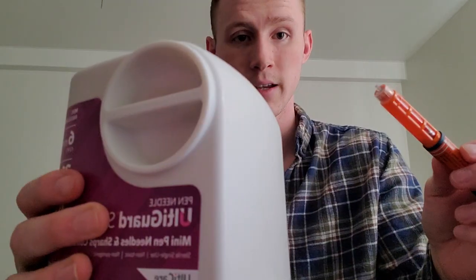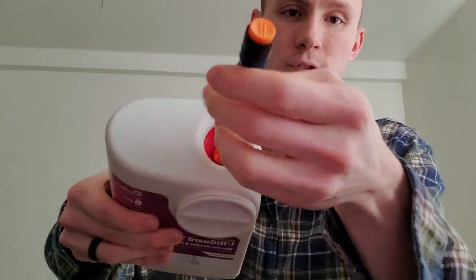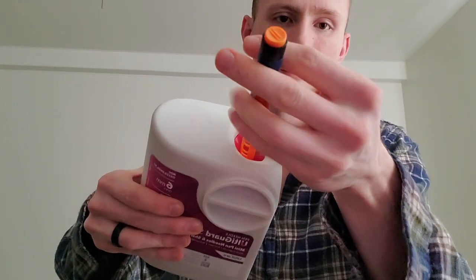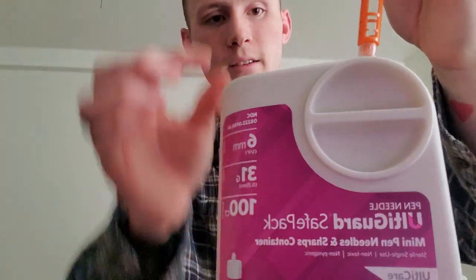We have this needle we need to dispose of. In my case, I have this little insertion hole right here. Take the needle, put it in, and twist, and that'll loosen the needle off the insulin pen. And then if I pull out, it should be off. And if not, like this is the case right here, it's not all the way off. That's okay. Just twist the rest off. Dump it in here, and I twist this, and it dumps it into a bin full of used needles inside of this. So that's going to be it. Yeah, that should be it.